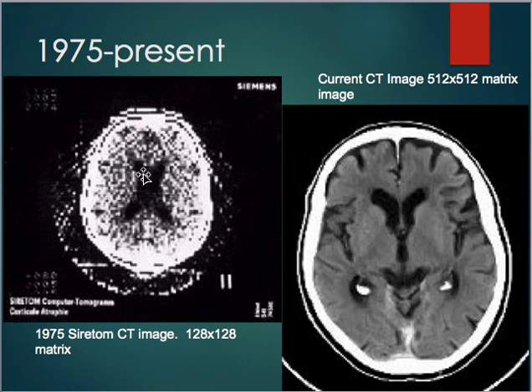This one you can see the ventricles right here, which is very good. I mean, doctors were amazed at this time. Back in 1975, they were amazed to be able to see the soft tissue structures of the brain and these black ventricles here for the very first time. They weren't able to see them originally before this, so this was huge. These ventricles are actually enlarged on this patient. But you can't see the soft tissue. All you can see are pixels.